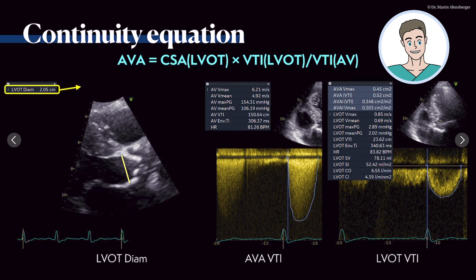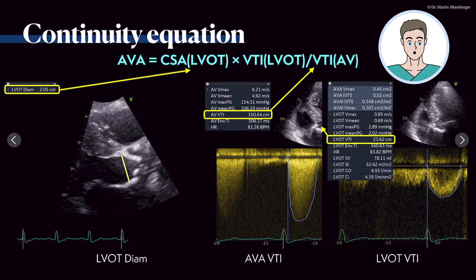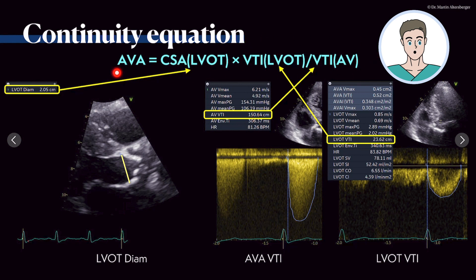Now let's discuss the continuity equation and what we found in this patient. For the continuity equation, we need the VTI — the area under the curve of the signal. This is the aortic valve signal, and the area here is 150.64 centimeters. This has to be put into the formula: the aortic valve area continuity equation, where you need the cross-sectional area of the LVOT, the VTI of the LVOT, divided by the VTI of the aortic valve.